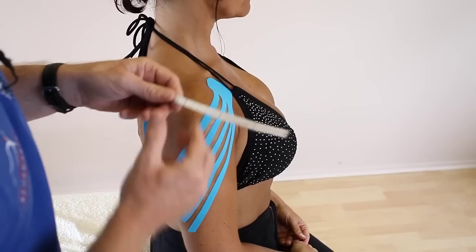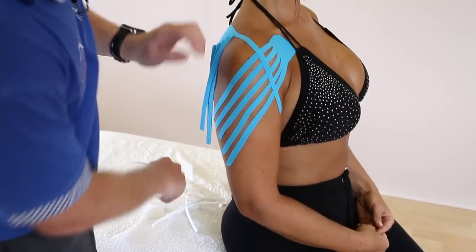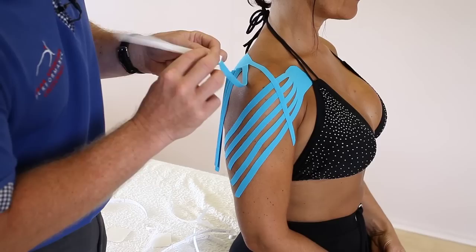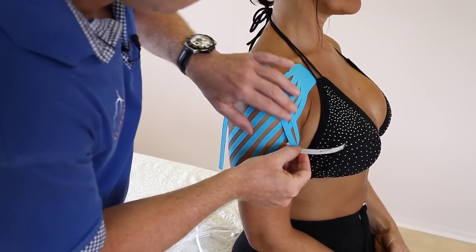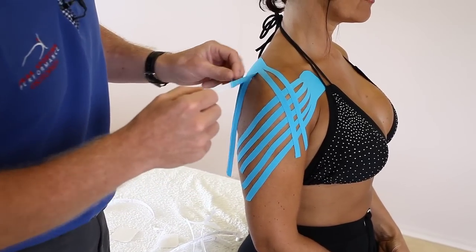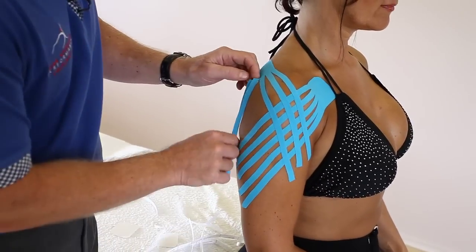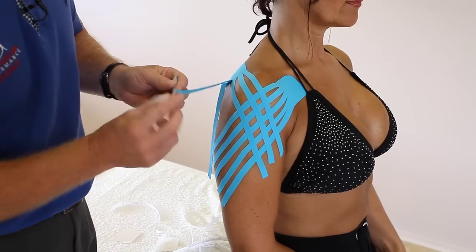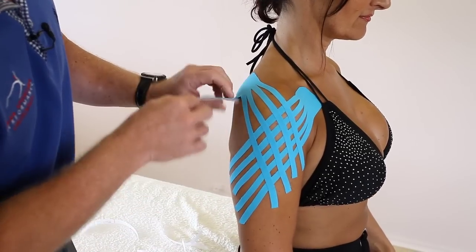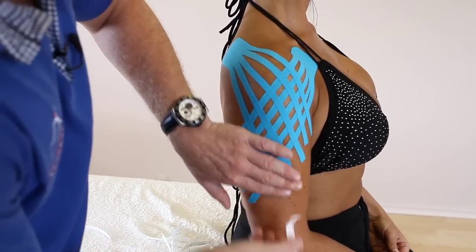And then the first finger is going to just cross, almost like a grid pattern, like so. The ends of each tape, if you wanted to round them off you're more than welcome to — it just takes a bit more time but it prevents it from lifting. And again the third one, lay right down, the fourth one, and the last one, like so.